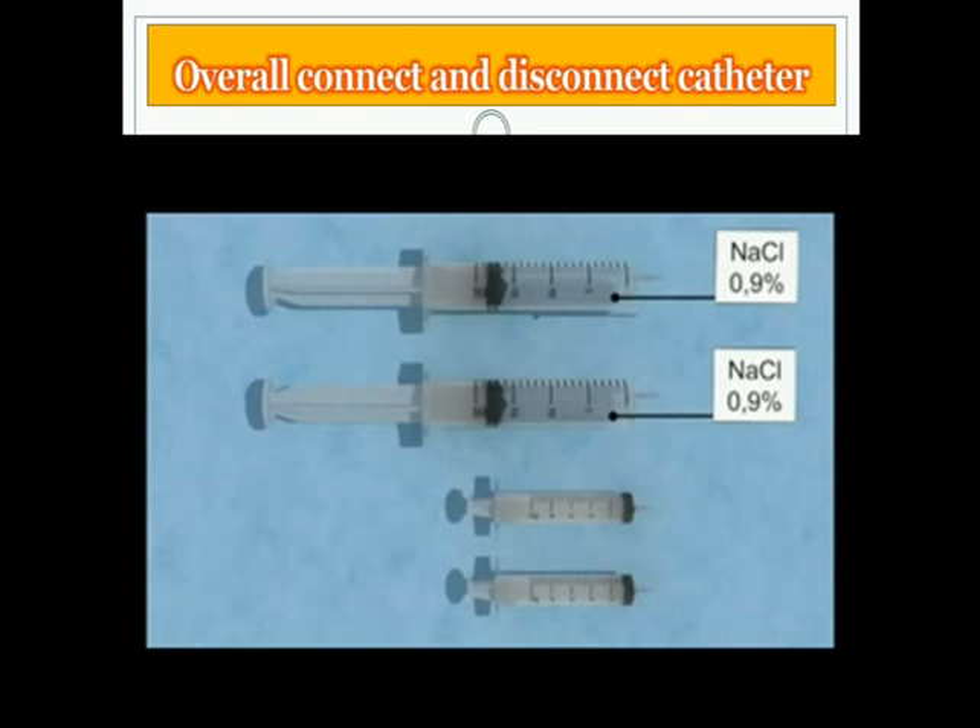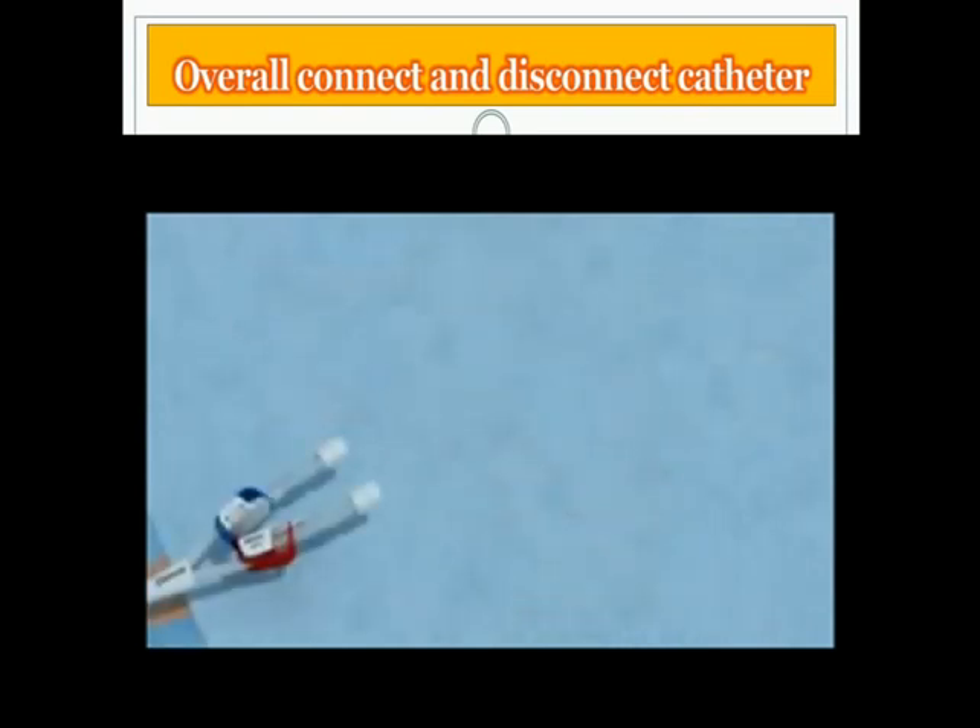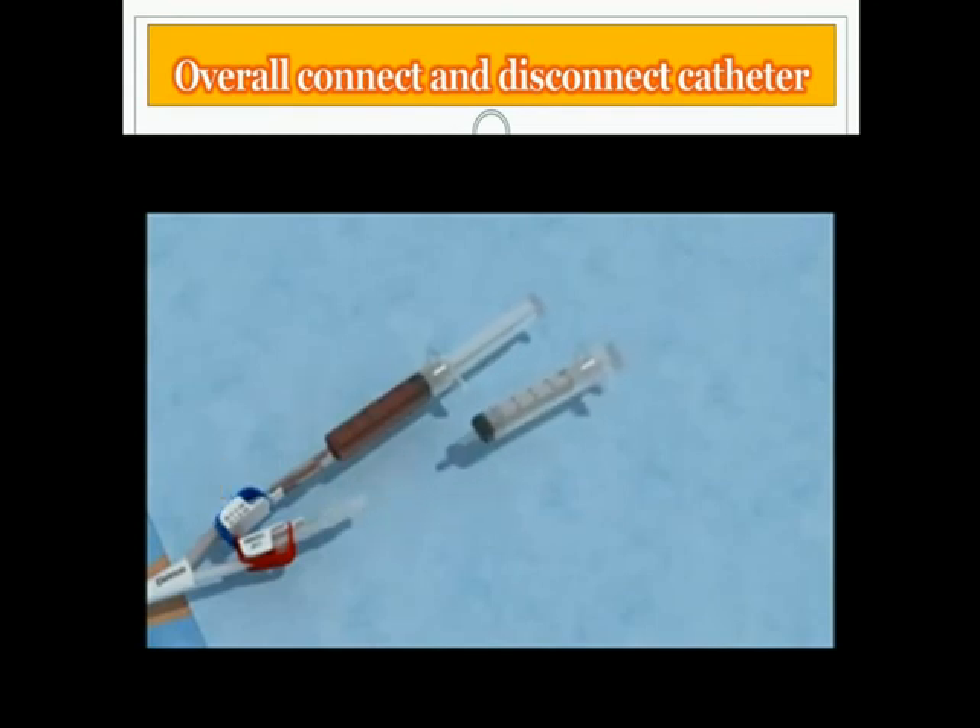Aspirate the CitroLock. Remove the cap from the venous lumen and connect the empty 5 milliliter syringe. Open the clamp and aspirate the former used CitroLock. Close the clamp and leave the syringe to block the port. Repeat the same procedure for the arterial lumen.